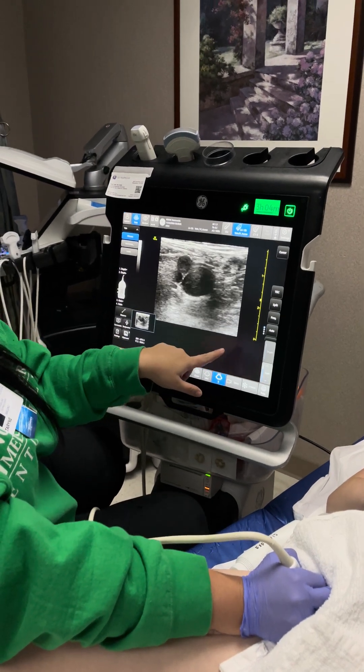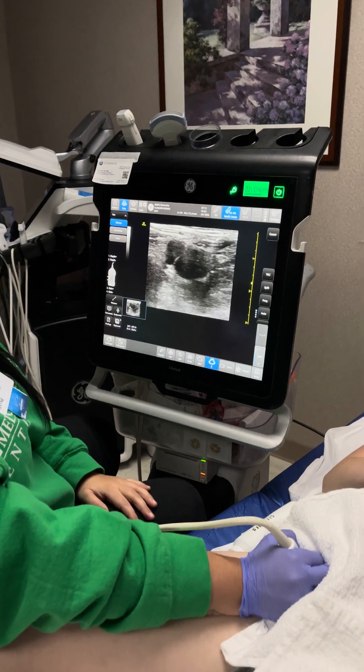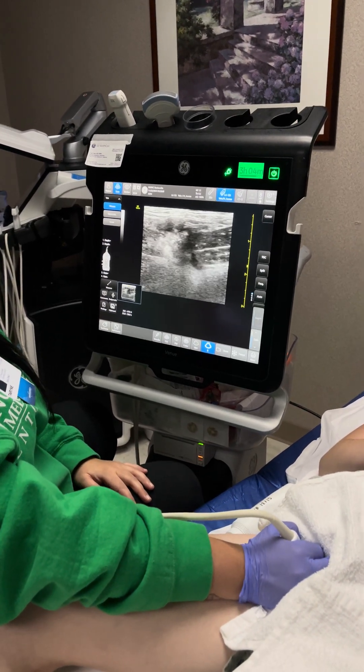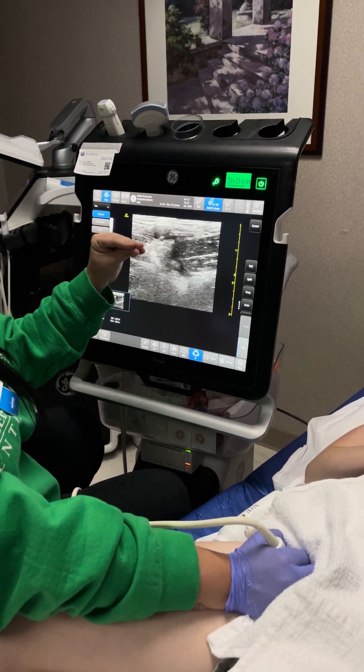We can turn down the color gain right there, kind of make it a little bit darker. We are just going to press on her, making sure that that vein completely compresses.